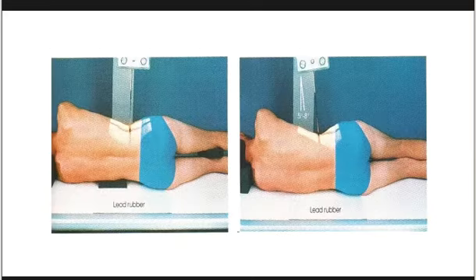So like for example, this position. So itong nasa left side natin dyan sa monitor nyo, yung nasa left side, that is where there is a lead rubber which is placed under the lower end of the ribs. So kung makikita mo, may lead rubber. Kung mayroong lead rubber, therefore the central ray should be perpendicular. Diba tayo, pag nag-x-ray tayo sa hospital, hindi natin yan tinitingnan. Diba?